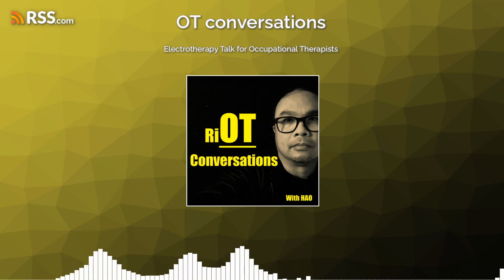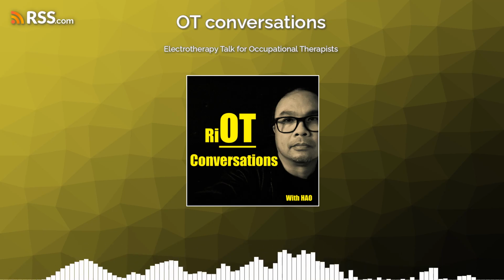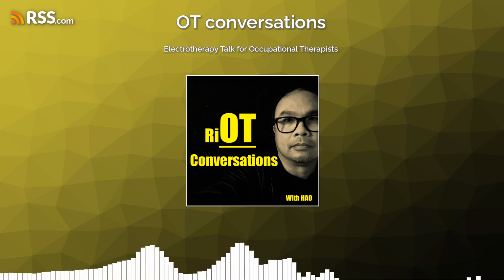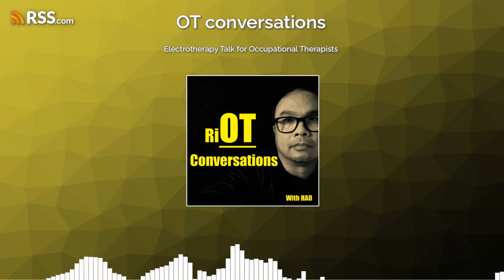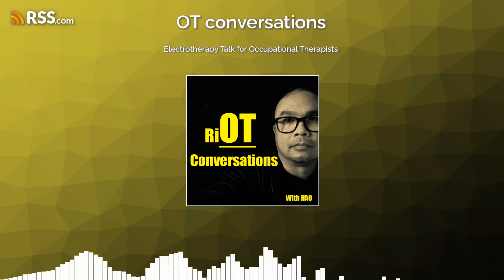There is a type that is called NMES, and this stands for neuromuscular electrical stimulation. This is stronger. NMES are like pulses. It stimulates the motor nerves to cause muscle contractions, and it will help to strengthen the weakened or paralyzed muscles.